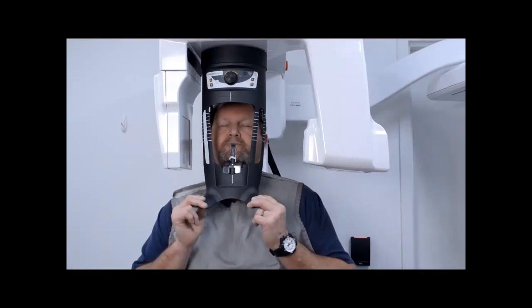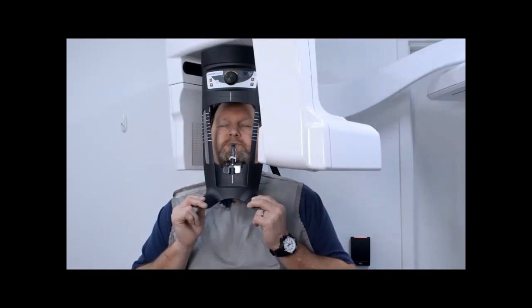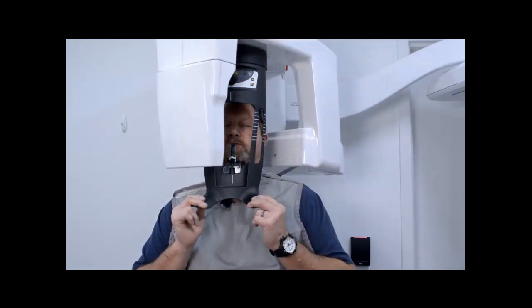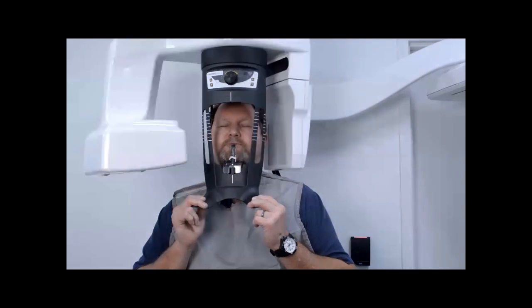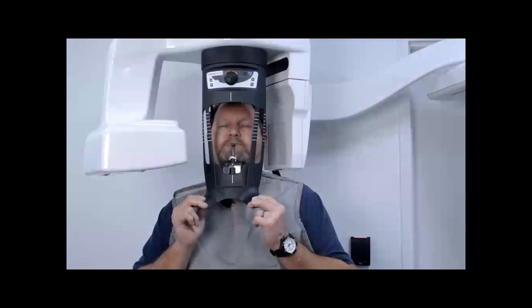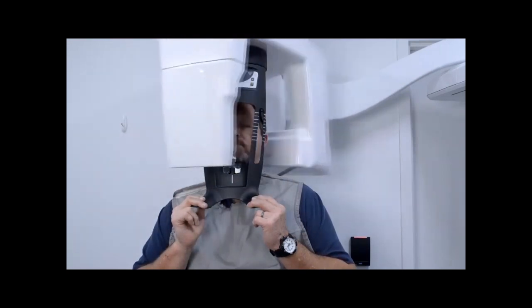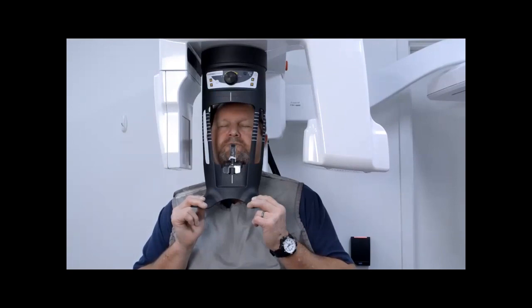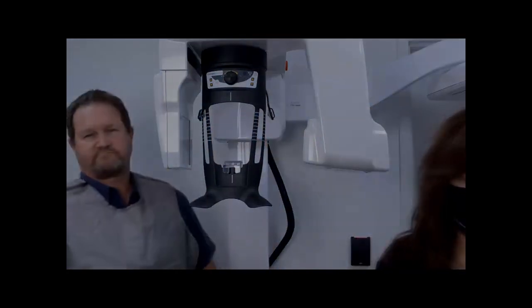Exit the room. Maintain visual contact with the patient throughout the duration of the exposure. Launch the x-ray with the remote control. Simply press and hold the exposure button until the end of the acquisition is indicated by the on-screen release hand switch message and a short beep. The x-ray exposure indicator turns yellow and a warning sound is heard during x-ray emission. When the acquisition ends, the acquisition interface disappears and the acquired image is automatically transferred to the imaging window. After the acquisition is complete, return to the room, release the patient, and remove the hygiene barrier from the bite block.